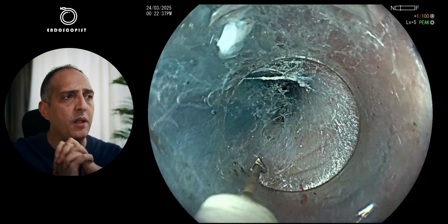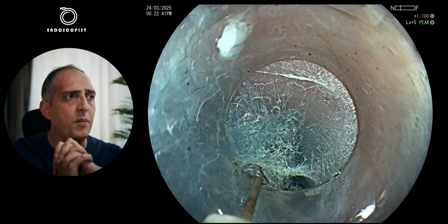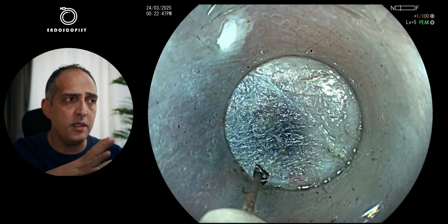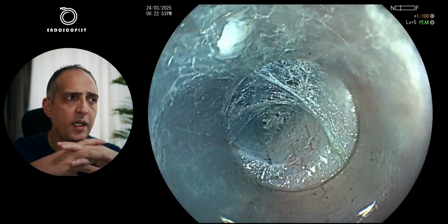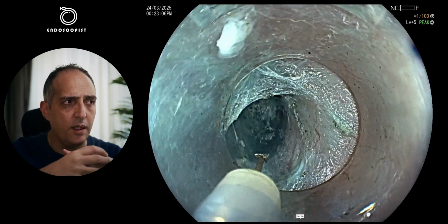We are approaching the cardia here, as you can see. Here we still have a couple of vessels. Whenever it is possible for me to leave the vessels intact, I just leave them. If they are on my way and I have to cut through them, I just cut through them. But again, as a rule of thumb for me, I will leave the vessels whenever I can.